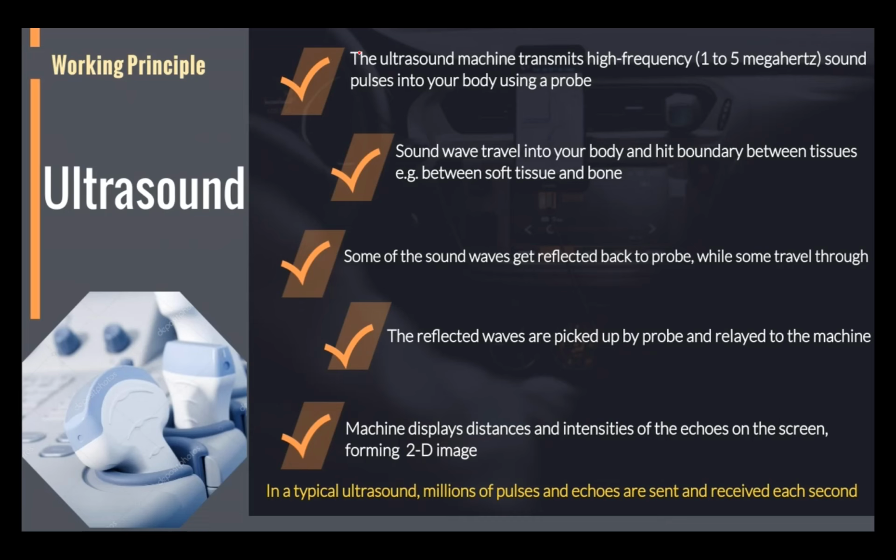The first thing is the ultrasound machine. Initially it will transmit high frequency sound. As I already told, ultrasound is high frequency sound, most probably in the range of 2 to 20 megahertz. In most cases it is 1 to 5, but if you go beyond 5 also, you get a good image. First I'm going to pass a high frequency sound into the body. How do we pass it? By using a transducer probe. So this is the transducer probe here. By using the transducer probe, first I'm going to pass high frequency sound.